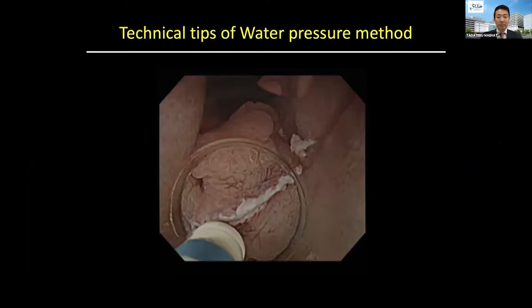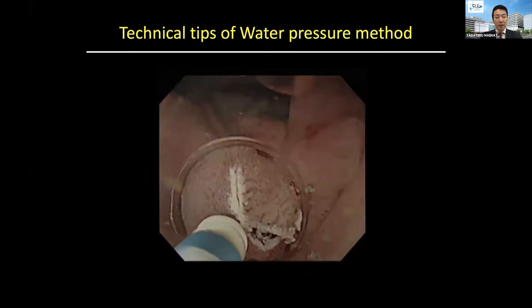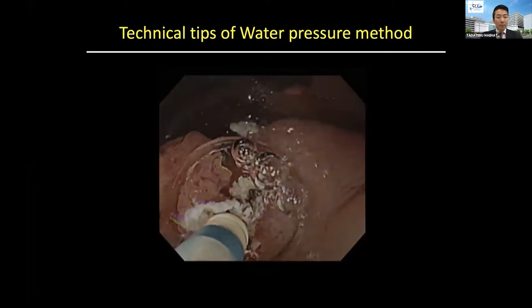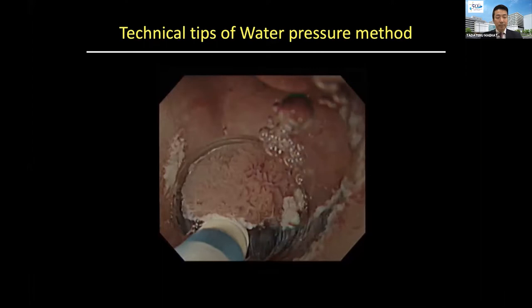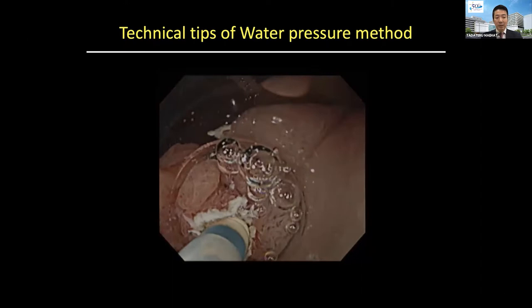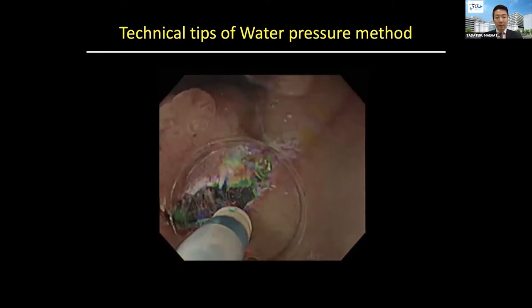Let me show you a video. After making our initial mucosal incision, the submucosal layer is difficult to visualize. After filling the inside of the lumen, the mucosal flap is floated by the buoyancy force. Water pressure using the water jet function further expands the mucosal incision line and improves visualization of the submucosal layer. We can dissect the submucosal layer while directly viewing it, which allows for a safe procedure.